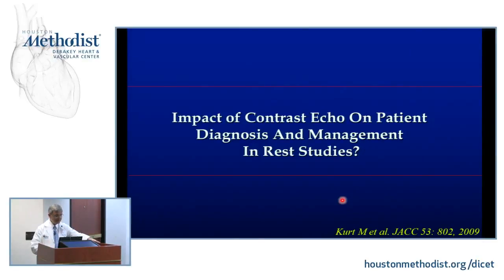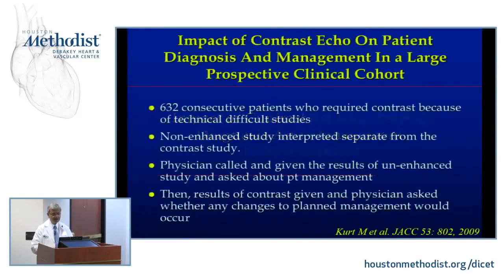So he was amazing. But we had this idea of actually trying to test and see what is the impact of contrast. And the beauty is that we empower our sonographers to do contrast whenever they want to, right? Whenever it's indicated. So we had 632 consecutive patients who required contrast because of technical difficulties. And what we wanted to do is look at not only the images, but also did it change what the physicians would do.